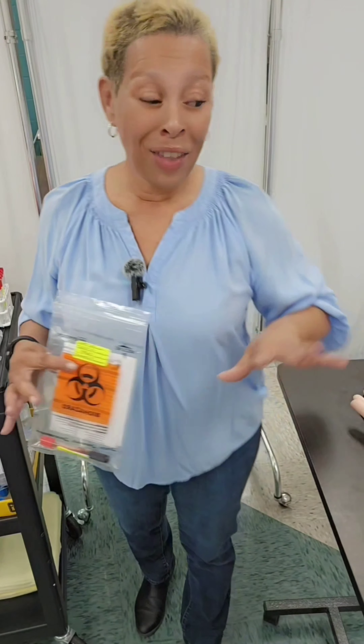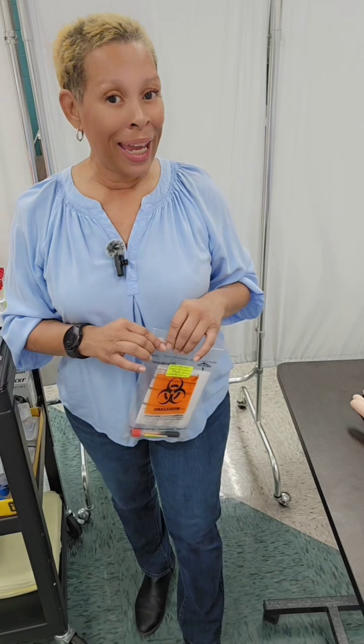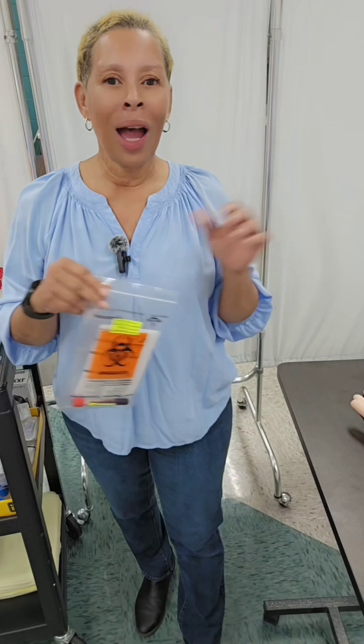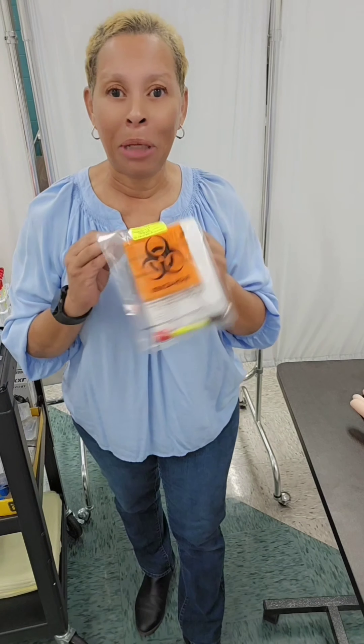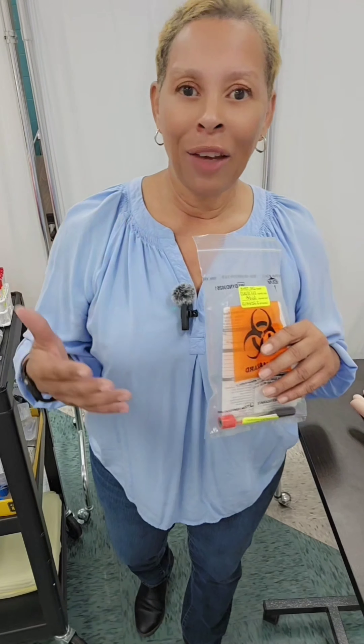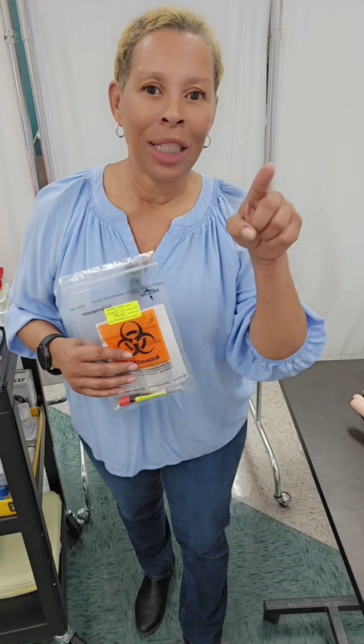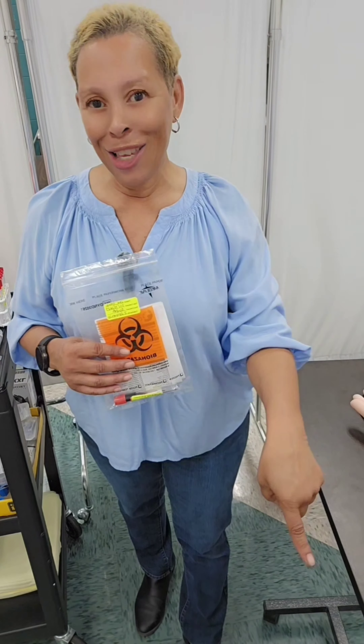Now that I've disposed of all of my supplies, I would wash my hands and then either walk the specimen down to the lab, call lab up to come pick it up, or — like in a hospital — they usually have a pneumatic tube shoot. You put it in the container, put it in the shoot, press the button, and it goes straight to the lab.